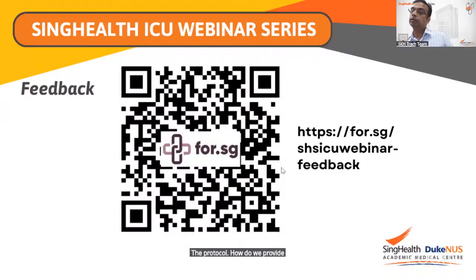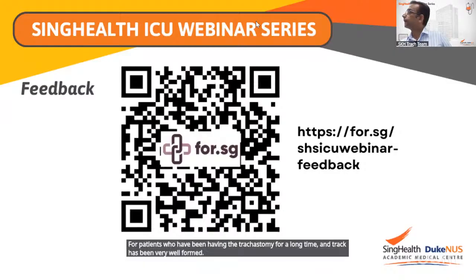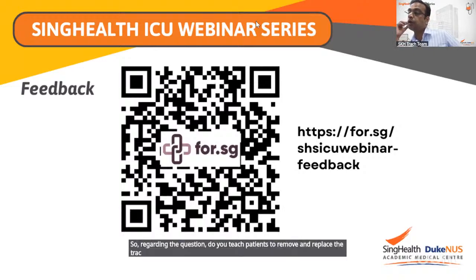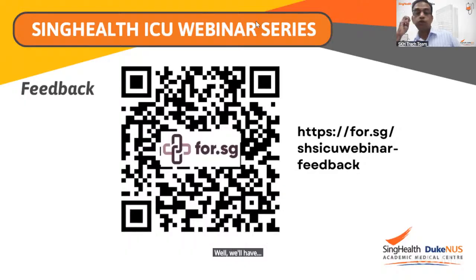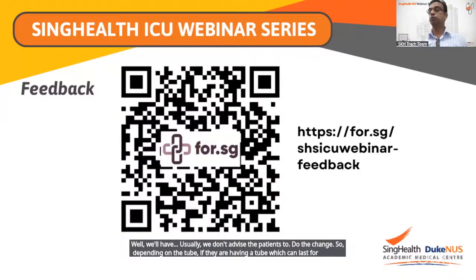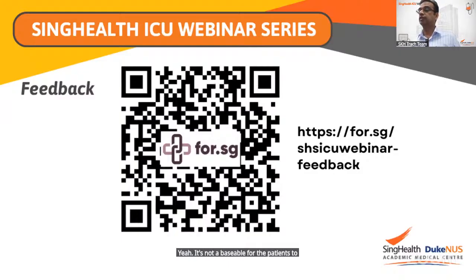Do you teach patients to remove and replace the tracheal tube on their own, for patients who have had the tracheostomy for a long time and the tract has been very well formed? Regarding this question, usually we don't advise patients to do the change. Depending on the tube, if it can last for 3 months, we will ask them to come back at the end of 3 months to change. It's not advisable for patients to change the tracheostomy tube.